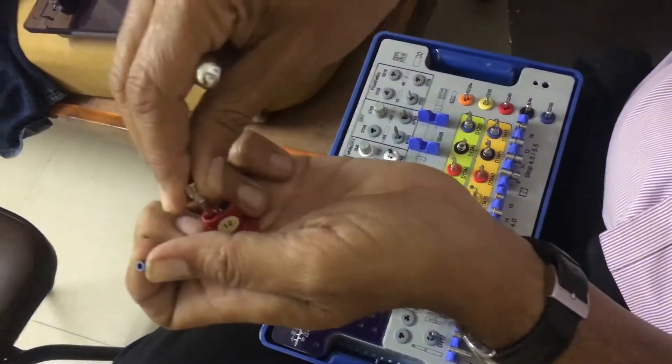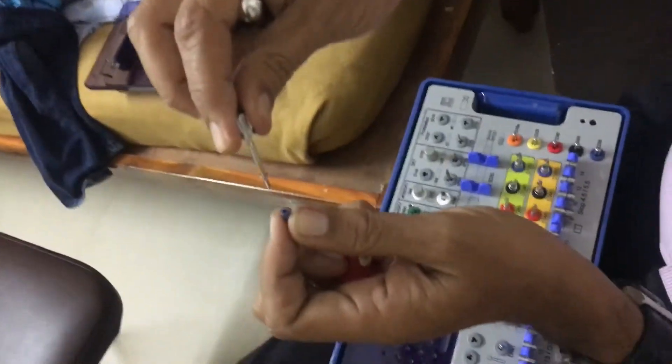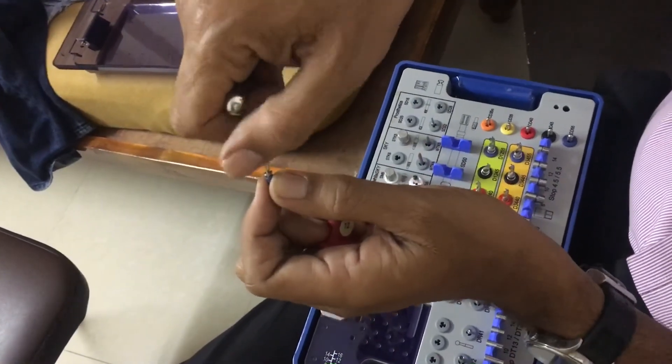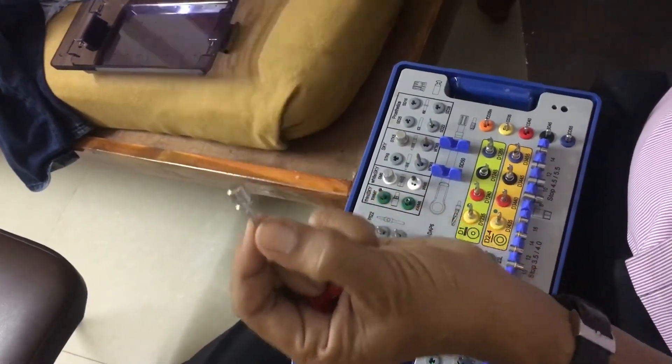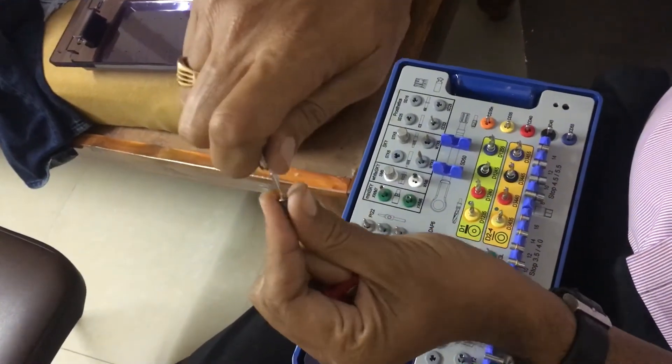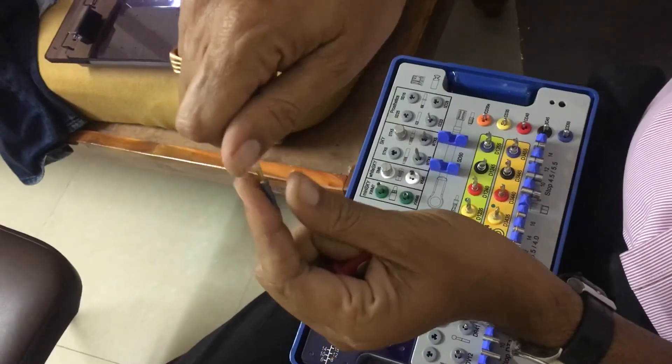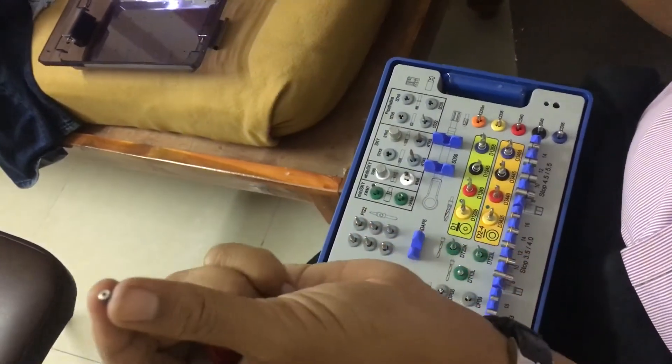From the other component of the vial, pick up your cover screw and tighten it. I have tightened it — the process is finished.